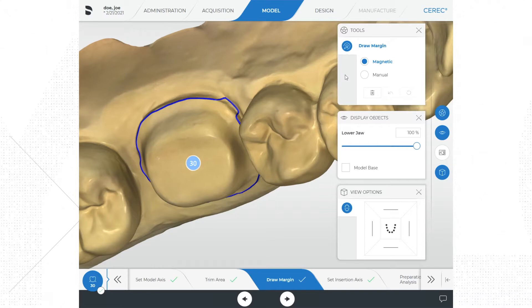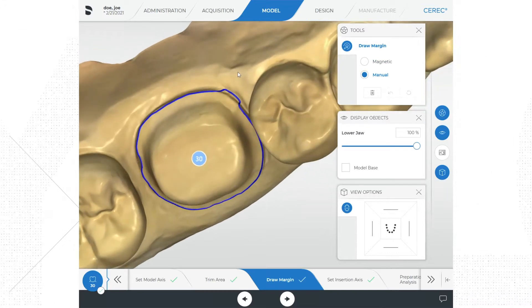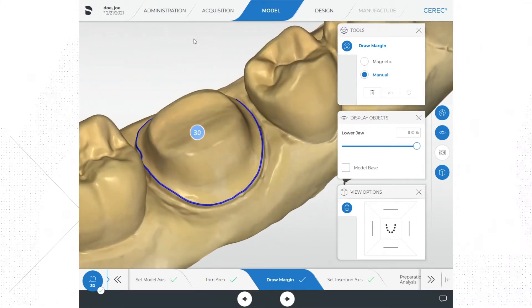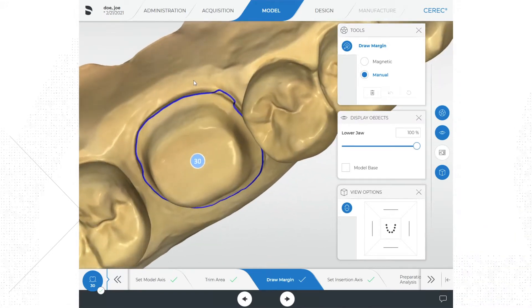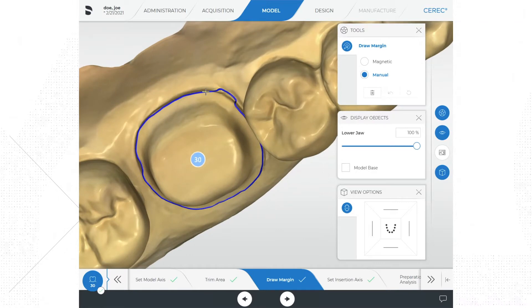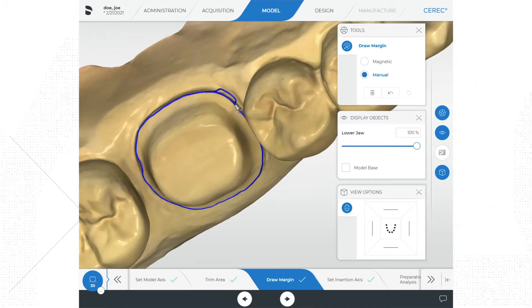I like to rotate the model and look at the margin tracing from different angles. Look for any places where the margin may have dropped off, moving down the side of the tooth, or where the tracing may have created peaks or sharp transitions. If you need to fix any areas, start on the left or right of the area that needs to be fixed and do a double left-click on the line. Trace over the area that needs fixing, doing small left-clicks along the way if needed, then lock off the adjustment with a double left-click.